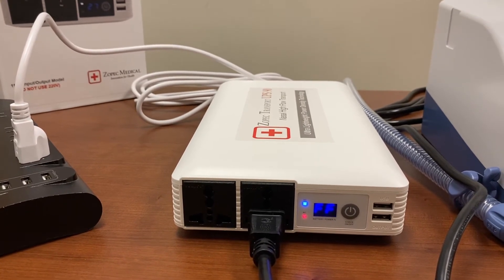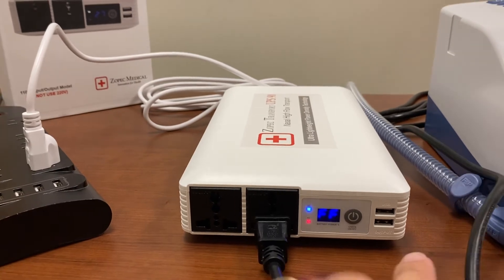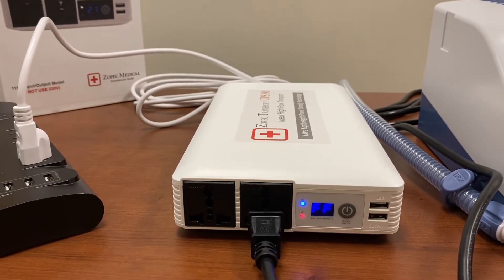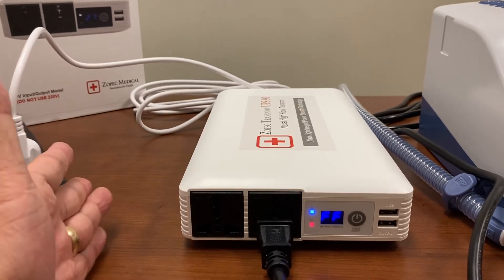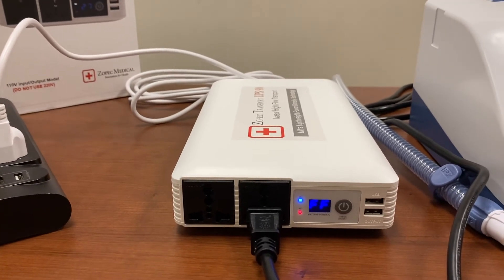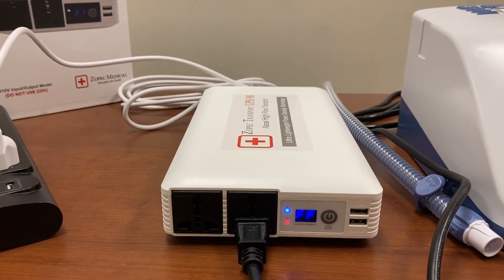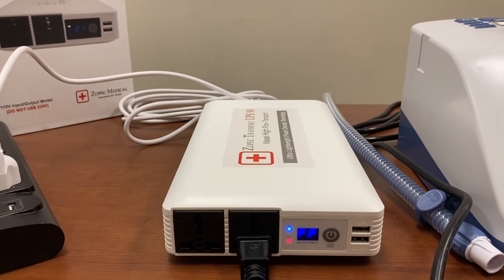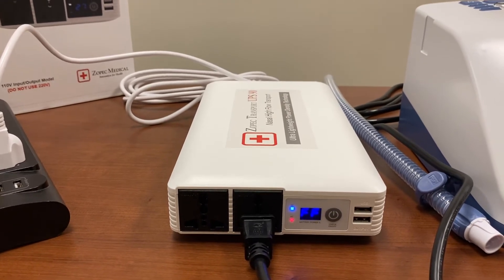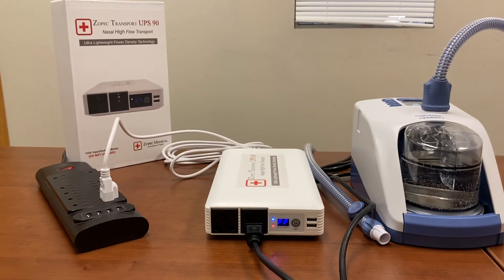90 minutes at 37 degrees Celsius and 60 liters per minute at the maximum settings. This is also why we added the USB port to run the AirGen nebulizer, because it transports for so long. Being so small, so light, and transporting so long, this allows you to add oxygen tanks to the cart, because you do need additional oxygen for transporting for up to an hour and a half. This UPS allows patients to go out for a walk with nasal high flow therapy and nebulizer therapy to get some sun, do physical therapy, for an hour plus.